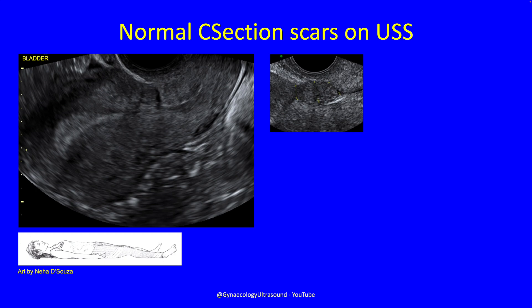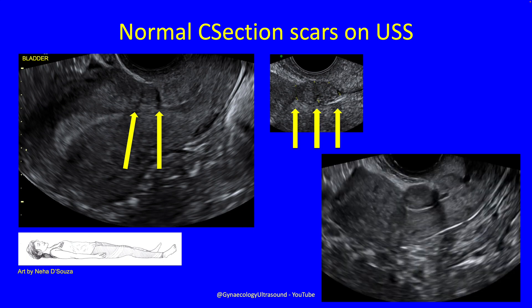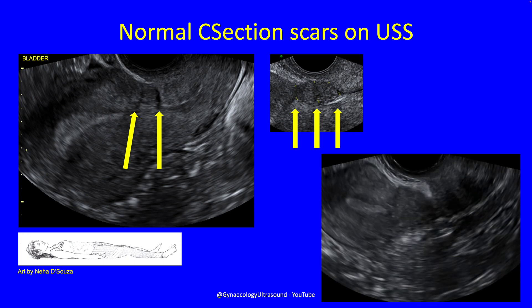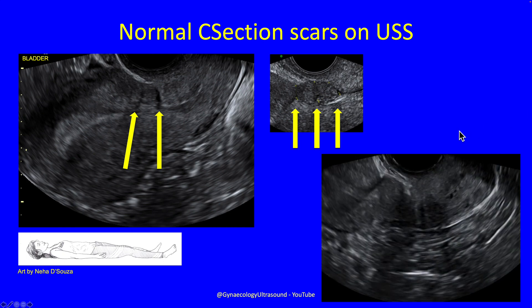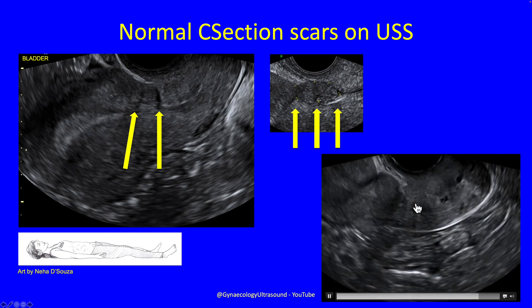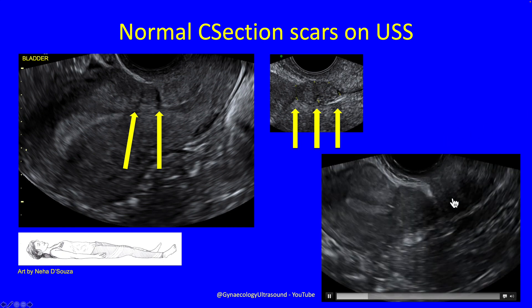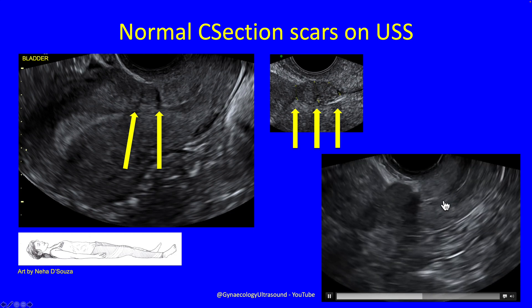So what does a normal section scar look like on ultrasound? This is a longitudinal view of the uterus — there's one section scar and there's another. This patient has had three caesarean section scars. This is a little video clip of two caesarean section scars; you can see one is there and one is there, and the internal os of the cervix is just about there.